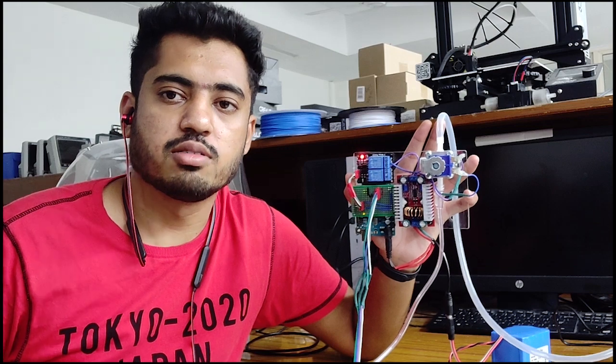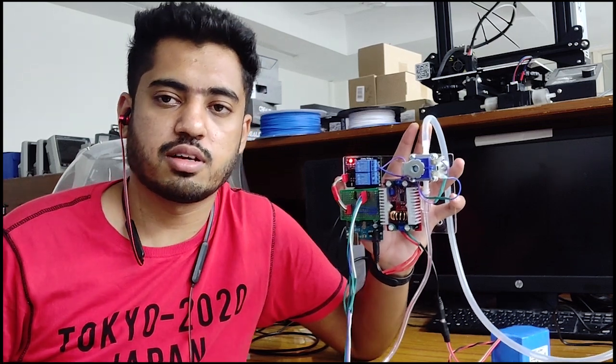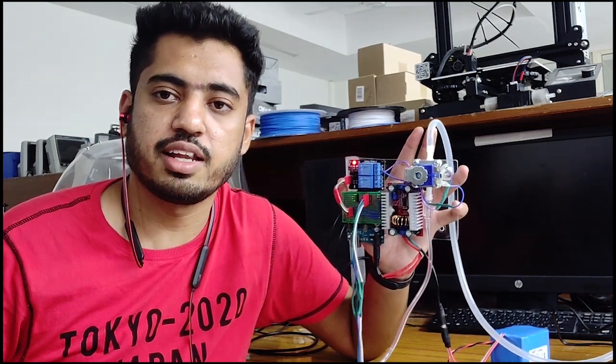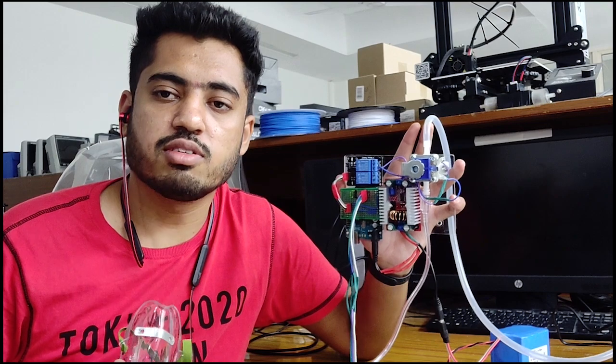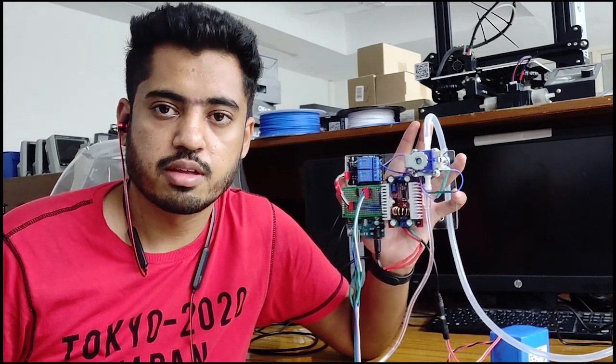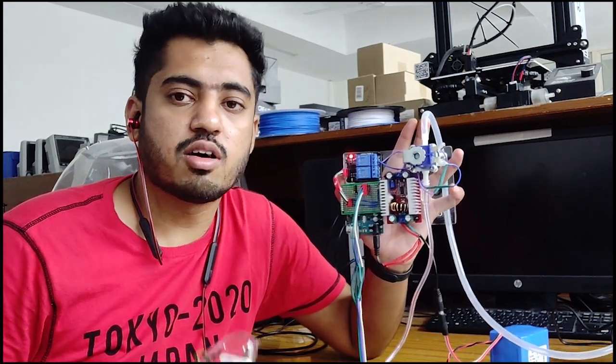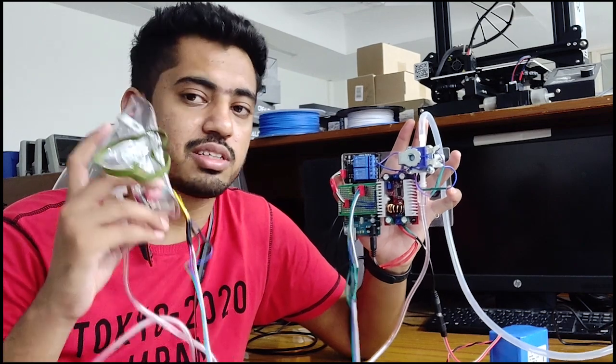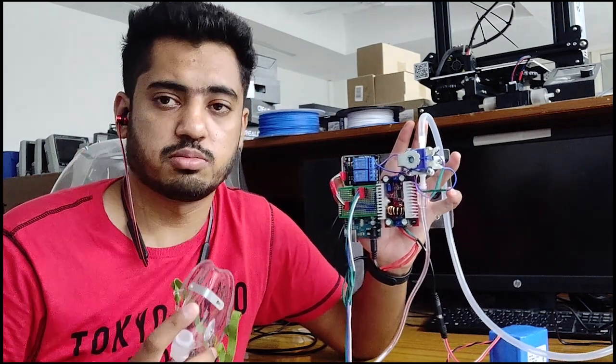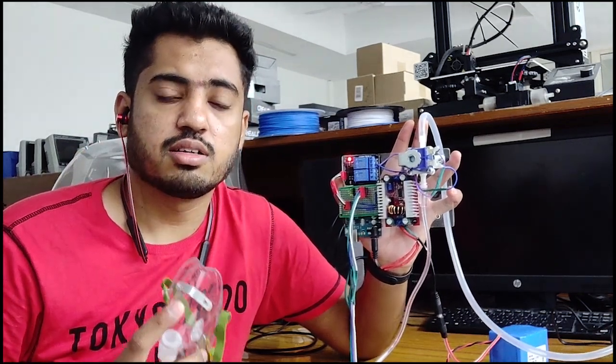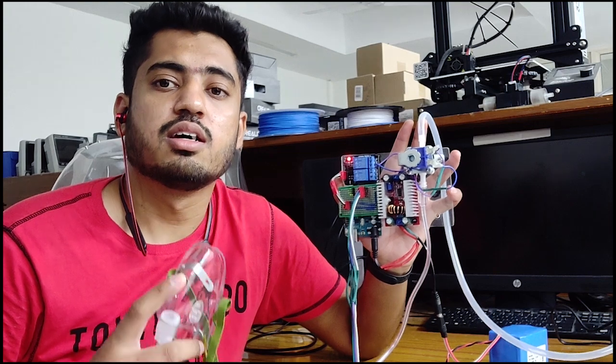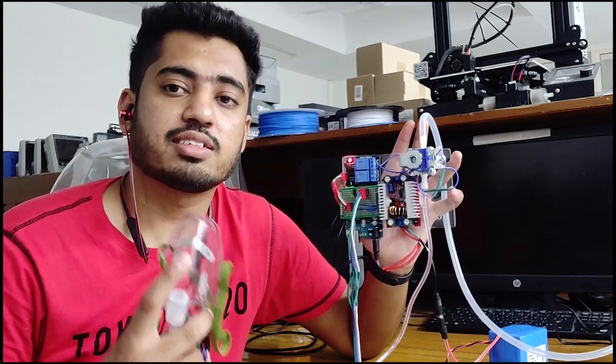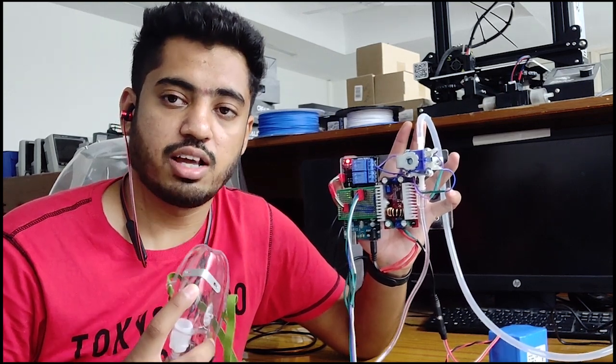Conventional systems allow a continuous flow of oxygen, irrespective of whether a person is inhaling or exhaling. During inhalation, the oxygen supplied to the patient using this mask is getting consumed, but the oxygen supplied during the exhalation process is getting wasted.